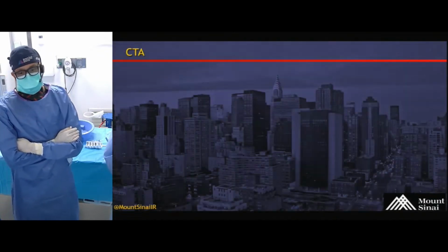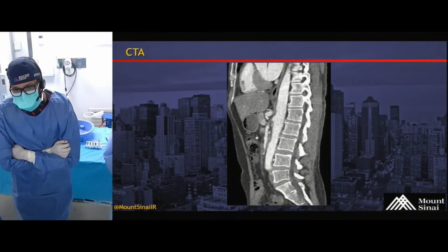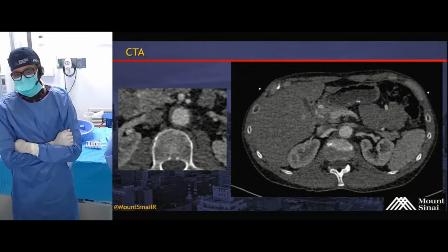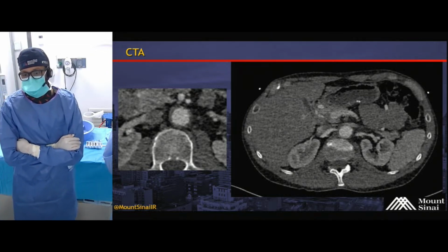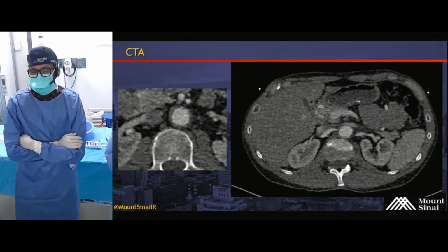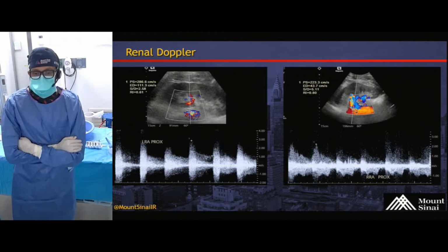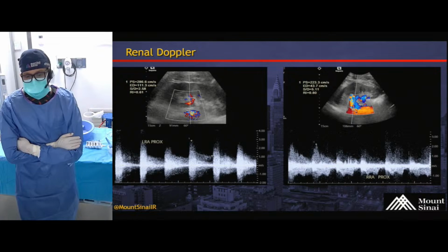Go to the next slide. So here's the sagittal just showing that proximal SMA occlusion with the flow in the distal portion. Go next slide. Here's just some close-up pictures. On the right, we see his two main bilateral renal arteries with pretty severe stenosis of the proximal portions, as well as soft tissue thickening around his abdominal aorta. And he had a renal duplex, which showed elevated systolic velocity in the proximal renal arteries bilaterally, up to almost 2 to 300.